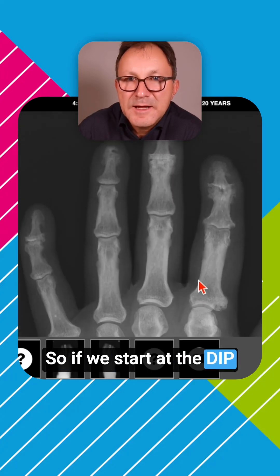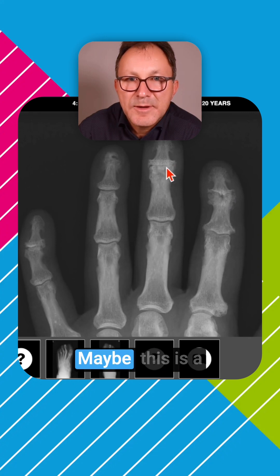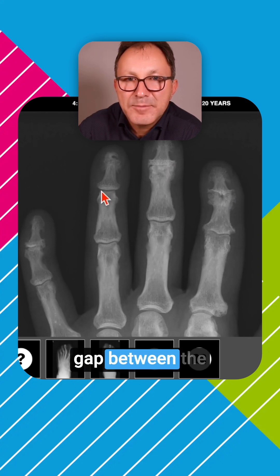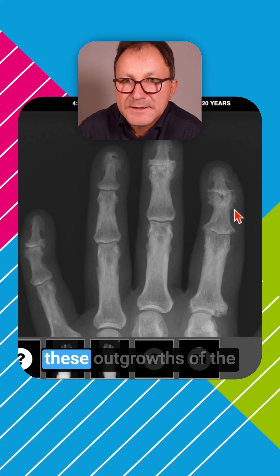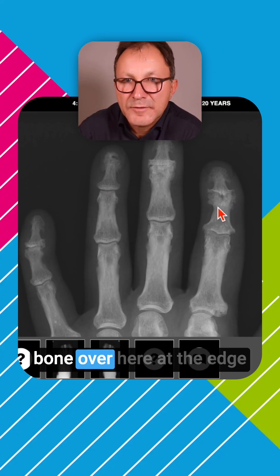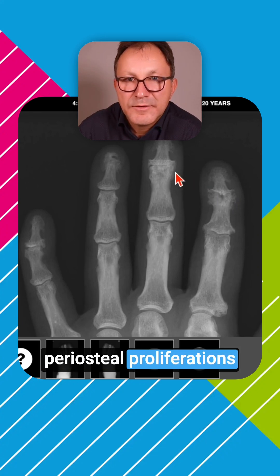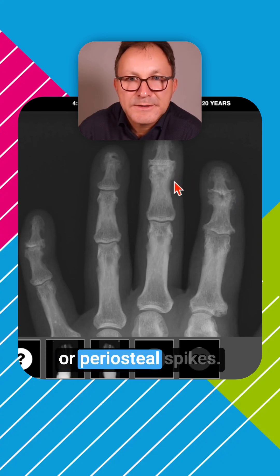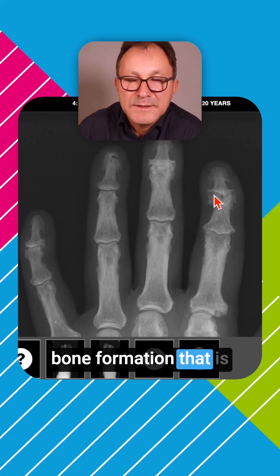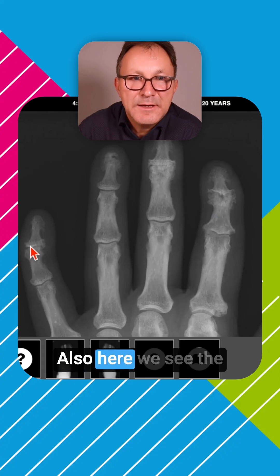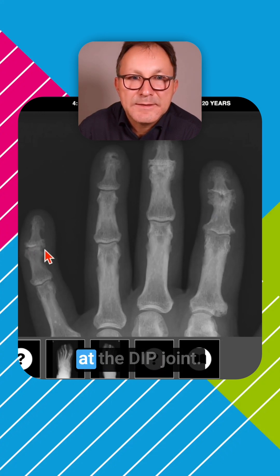Starting at the DIP joints, we see that there are no joint spaces visible — maybe this is a normal joint space. This gap between the bones should be visible here and there. There are outgrowths of bone at the edge of the joint; these are called periosteal proliferations or periosteal spikes. This is new bone formation caused by psoriatic arthritis. We also see psoriatic bony outgrowth at the DIP joint.